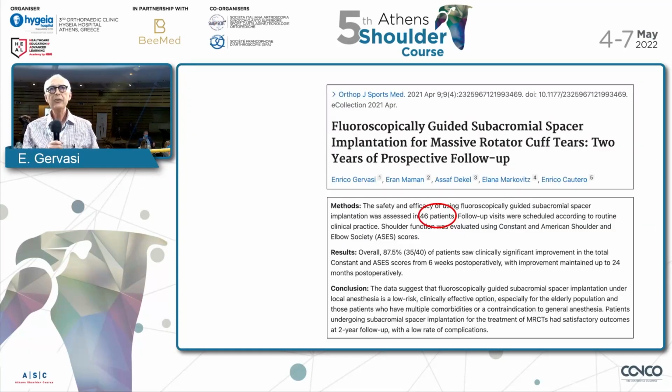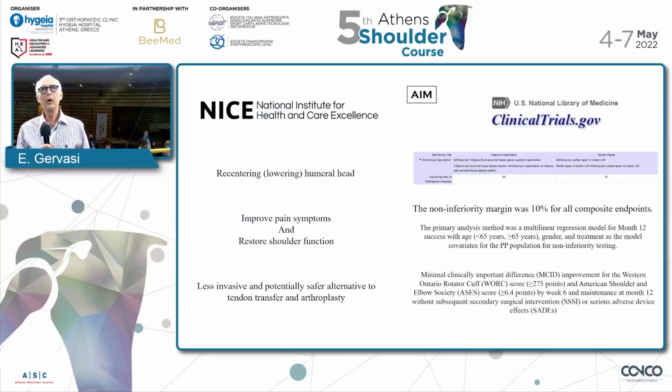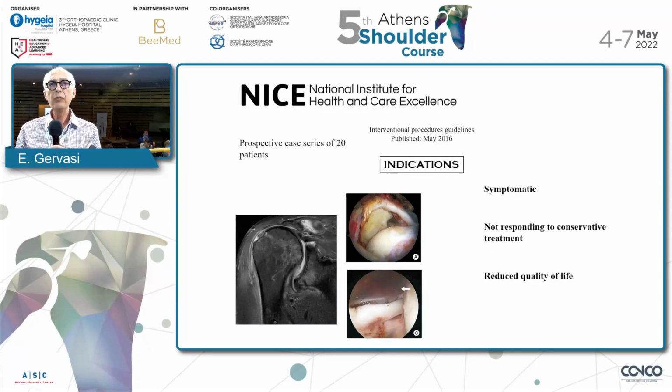I did a prospective study with 46 patients follow-up, and I had 3 patients going to reverse, and the other patients improved with the ASES score and the other scores we considered. There are many other papers. This is the National Institute for Health and Care Excellence considering the use of the balloon to restore function for symptomatic shoulders not responding to conservative treatment and reducing quality of life.